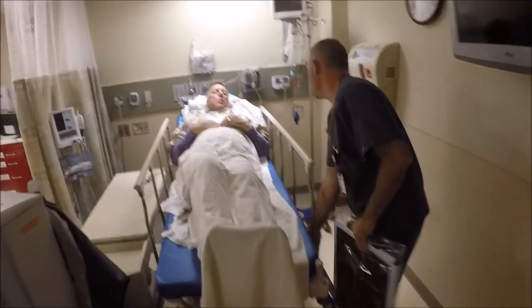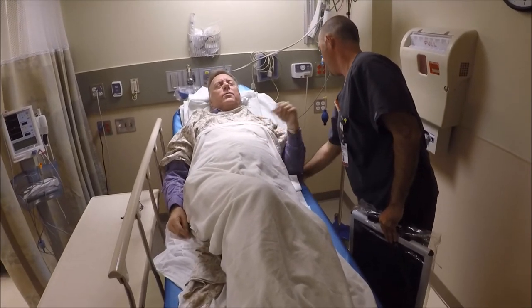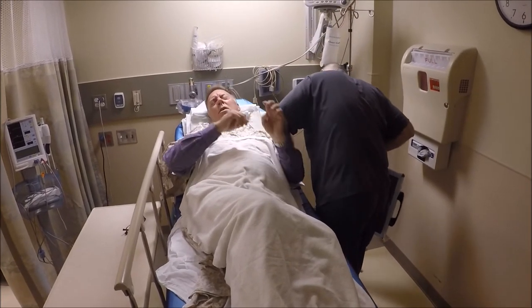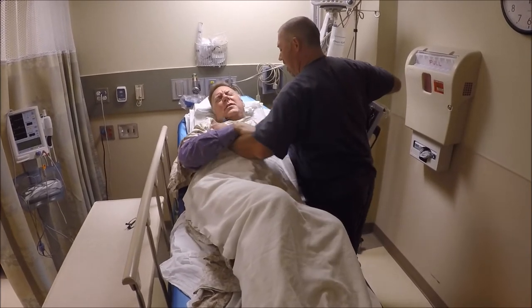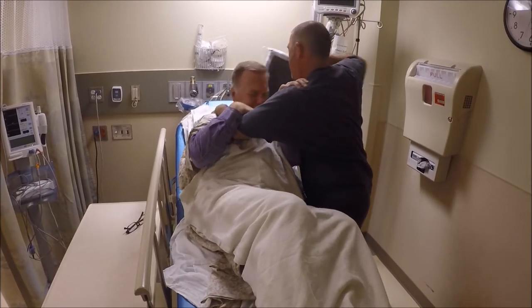Get your rail down here. Try not to roll on me. Keep your hand in here — don't want to pinch your fingers. I need you to try to cooperate. We've got about six more of these to get done, so I need your help here. I've got to lean you forward here. I want you to reach underneath my arm. Here we go. On three — we're going up. One, two, three. Up we come.